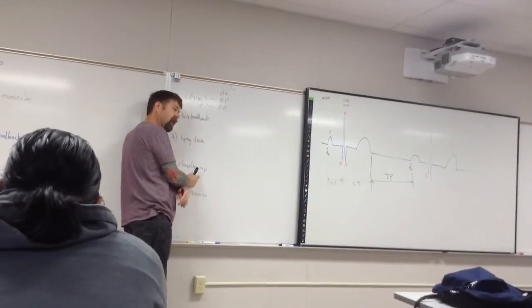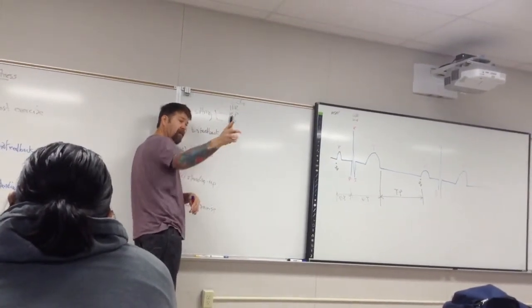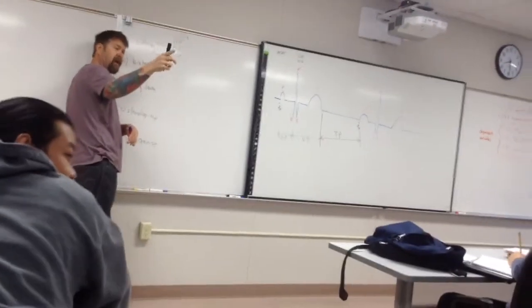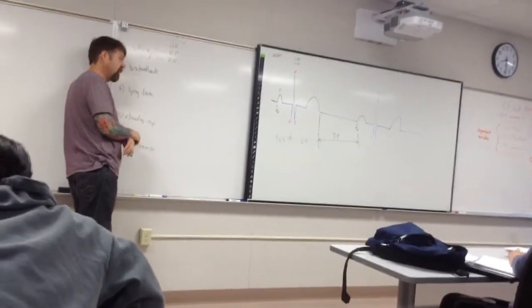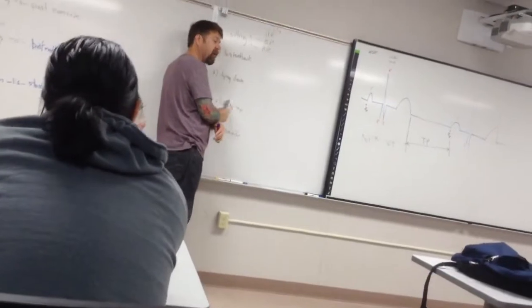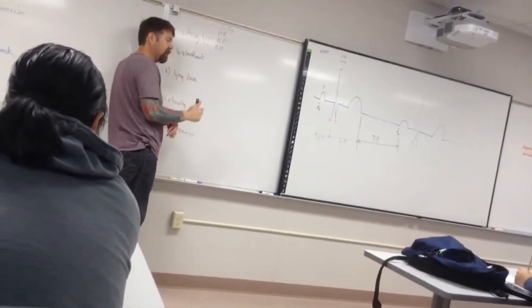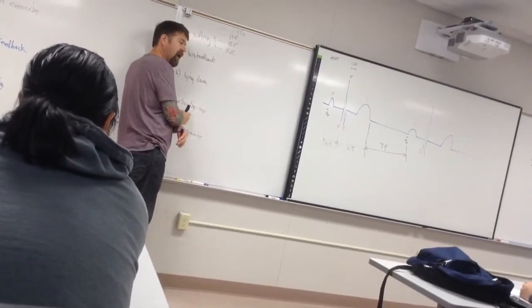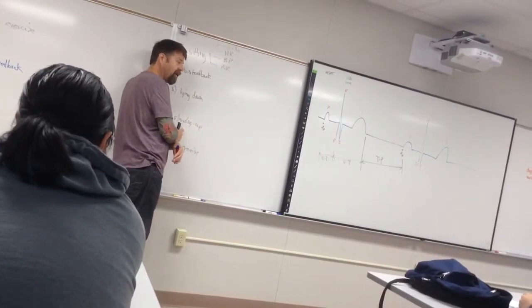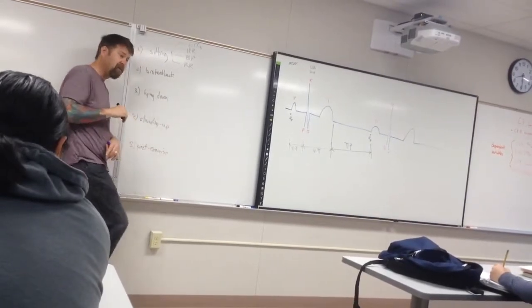Now this is the difficult one because you want it as soon as they get vertical, standing up or sitting up or whatever. If you're lying on the back counter, be careful you don't hit your head on the cabinets, I guess. This is the best way to do this here, but whatever. Because then there'll be no blood pressure anymore. As soon as they get vertical, you're hitting record. You're recording the heart rate, recording the EKG, recording the respiratory rate, taking the blood pressure as soon as they're vertical. Because remember, in a matter of about 5 seconds, this is done. So if you don't get that blood pressure quick and that heart rate quick, you're not going to see it. And that's okay, but we'll just do the best we can.